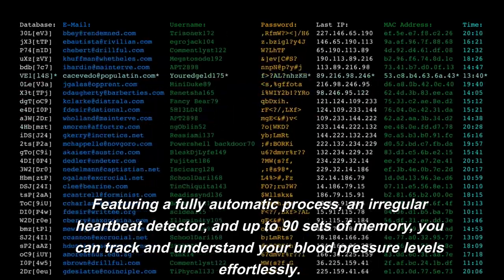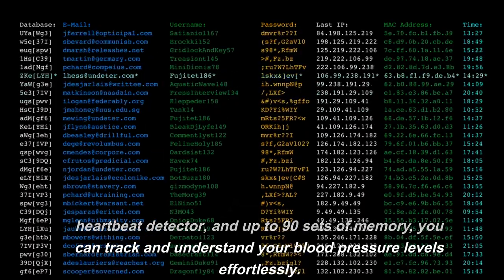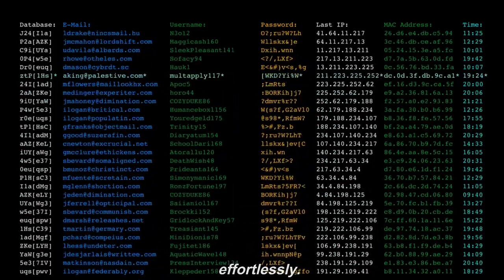Featuring a fully automatic process, an irregular heartbeat detector, and up to 90 sets of memory, you can track and understand your blood pressure levels effortlessly.